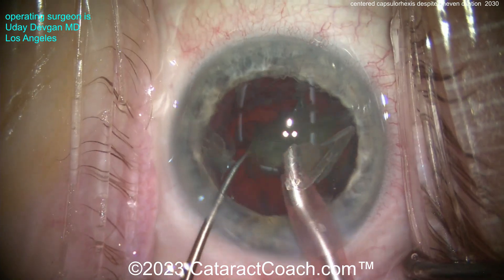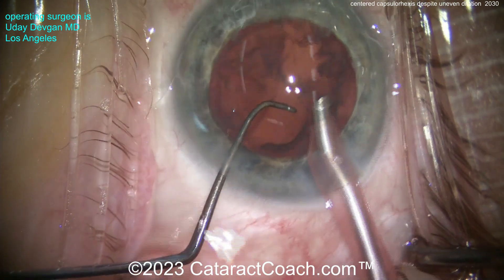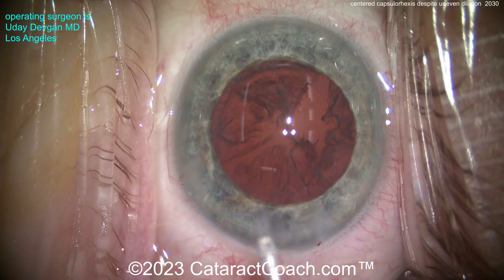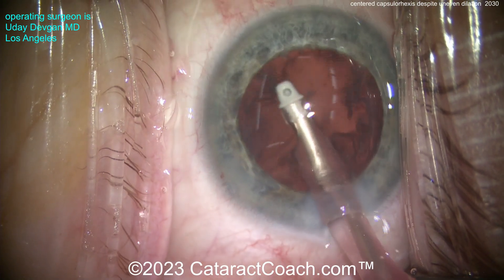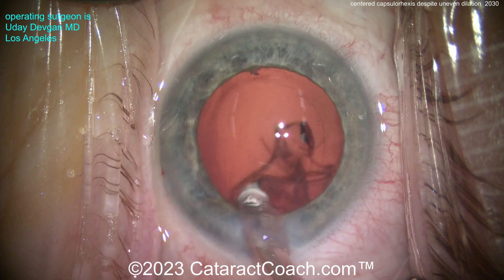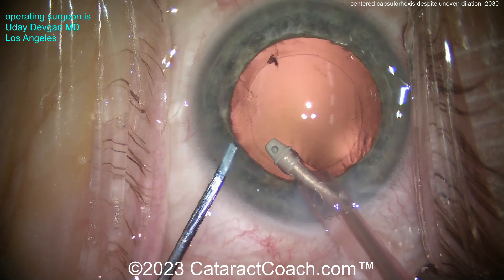What I want to show you is obviously the end of the case here where you see the rhexis. For whatever reason, you can see there's a little bounce in the pupil, in the iris — a little bit of asymmetry there. This patient does have some floppy iris syndrome, some IFIS, and we're managing that pretty well. Notice how I came out in position one very gently to not let the iris prolapse. Now let's take the I&A probe, go inside the eye, take out the cortex. And you can see at the end we'll have a beautifully centered capsulorrhexis that's going to overlap our optic 360 degrees. Cortex removal is pretty straightforward here, and you can see there's the outline of the rhexis — it looks pretty good. But during the capsulorrhexis creation, you saw the iris dilation was not totally symmetric.